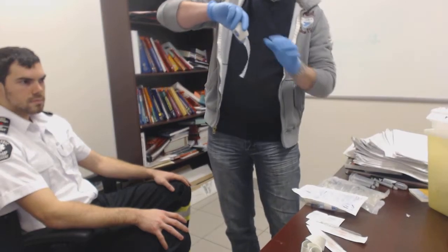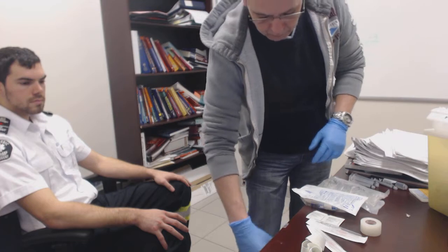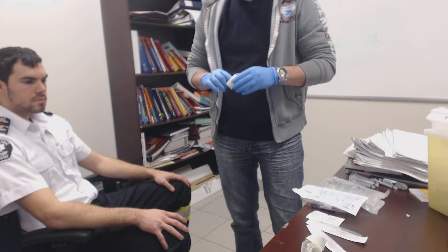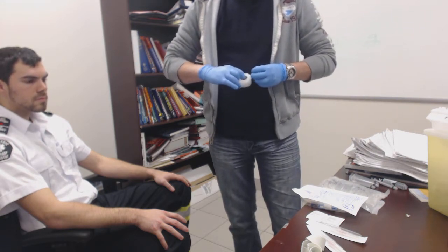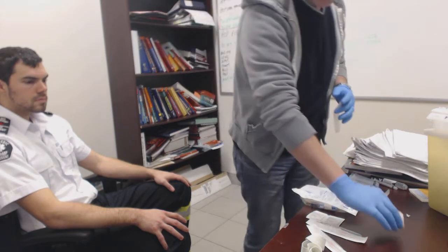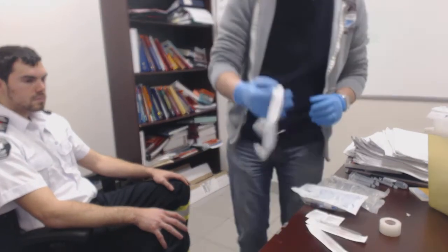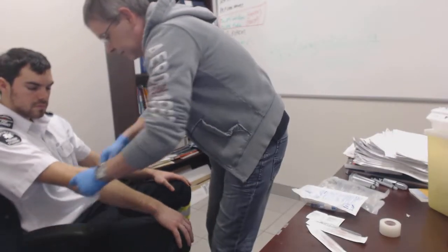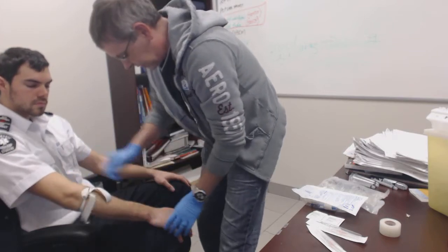So the indications for starting an IV is one, medication administration, two is fluid administration, and finally is expected clinical course. So our patient is sick, we expect that he's going to need either fluid or medication in the future, and so we're starting our IV. Have all my equipment laid out. Put my tourniquet on. And you always want to try and work distally and work your way up.